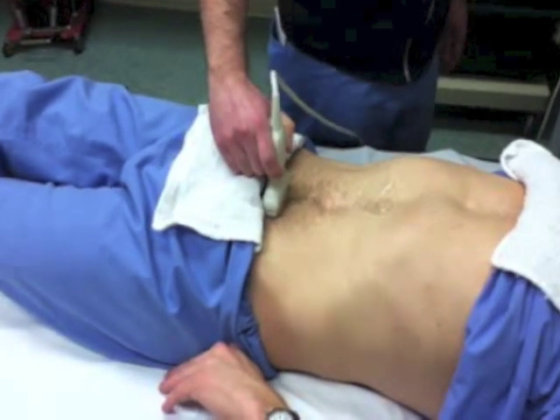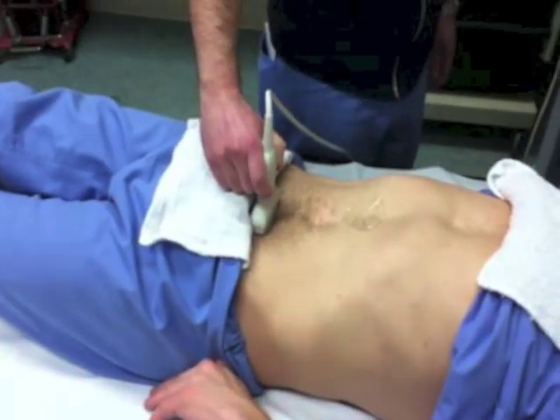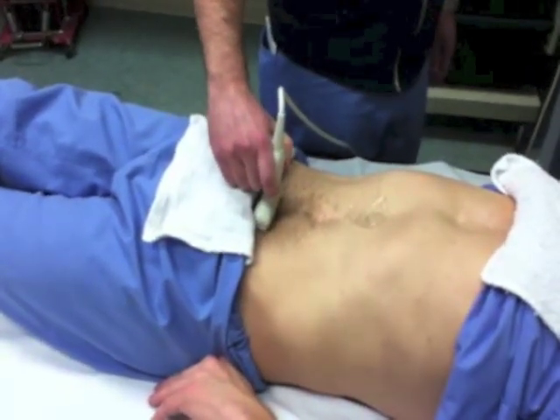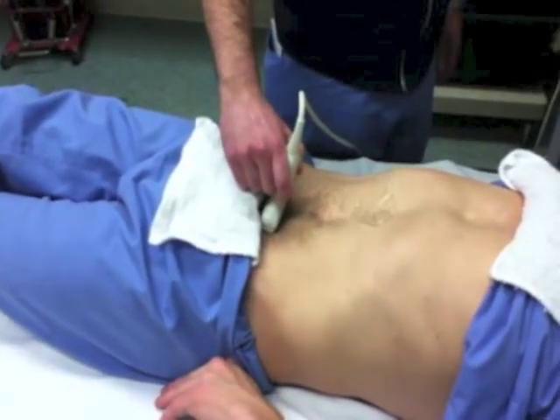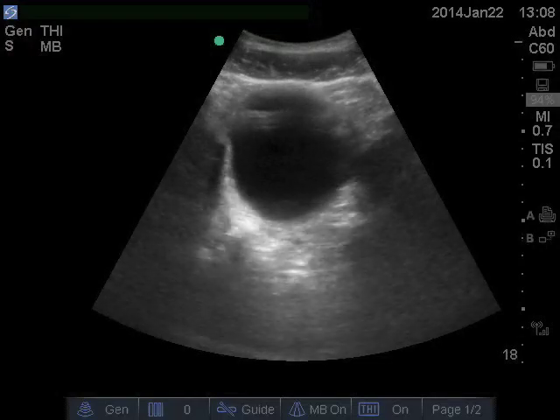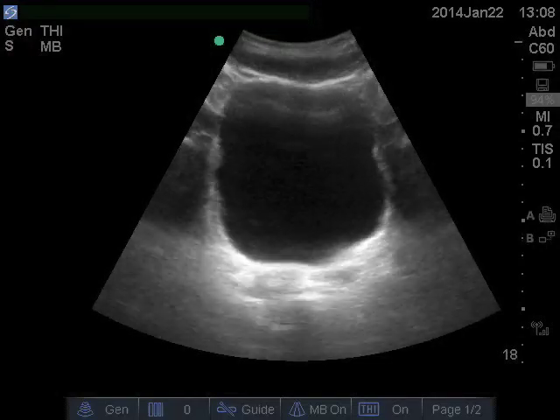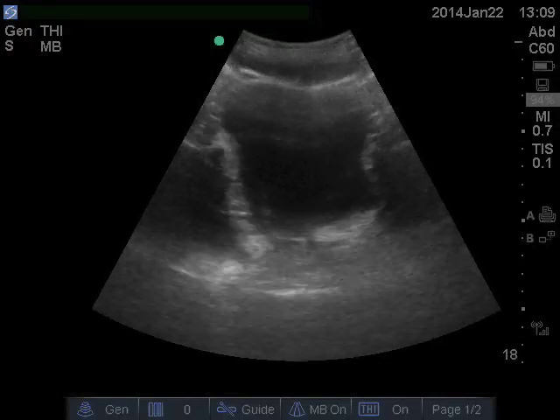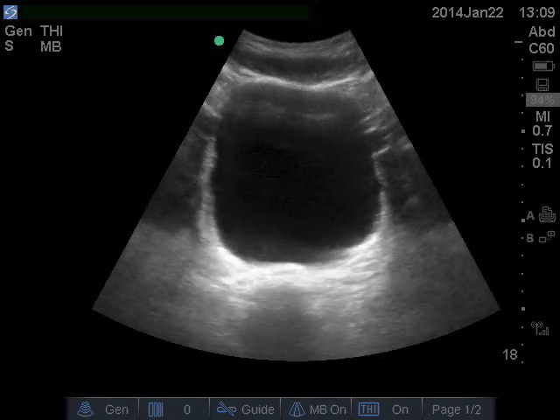To start, place some gel on the probe in the center of the patient's pelvic area. Tilt it down into the pelvis until you find the black, urine-filled bladder. Rock it up and down until you find the largest dimensions.